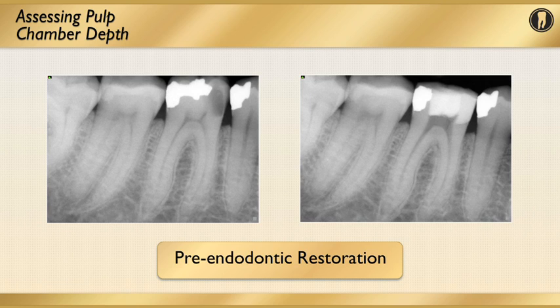If you notice preoperatively on the radiograph on the right, you notice a preoperative restoration of the tooth before instrumentation and completion of the endodontic procedure has been accomplished. Taking the time to provide 4 walls, to provide the isolation through preoperative restoration is never underestimated and cannot be considered something unimportant. We have to discipline ourselves to provide us with 4 solid axial walls for the retention of chemicals and for disinfection of the canal space.